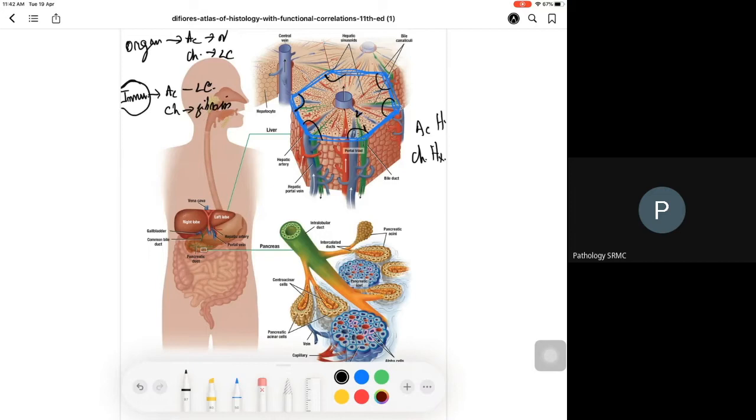Most of the hepatitis are immune based disease, even though they are classified hepatitis A, B, C, D, E, it is immune based. There is a lot of lymphoid infiltrate. When you see these lymphoid infiltrate confined to the portal triad, that is chronic hepatitis. When do you call acute hepatitis? When the lymphocytes spill over into the lobules from the portal triad, then you call it as acute hepatitis.